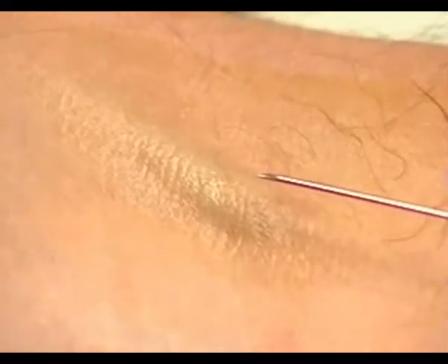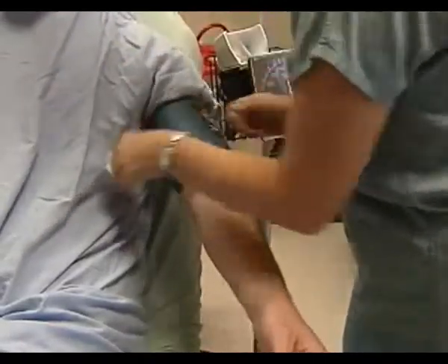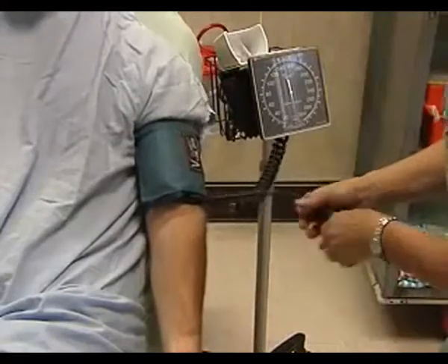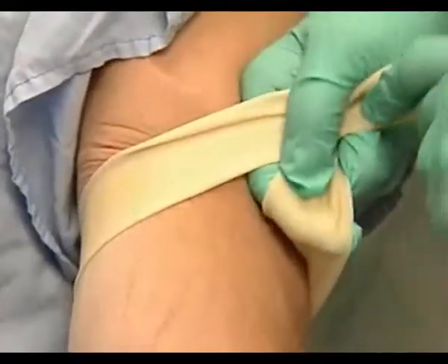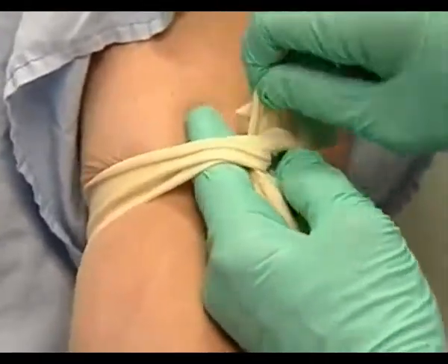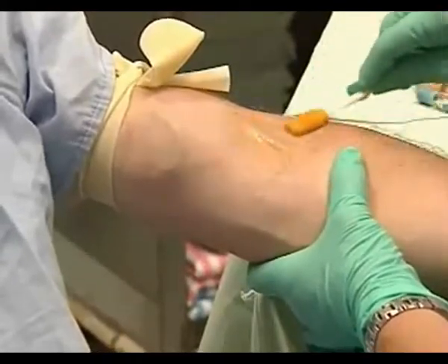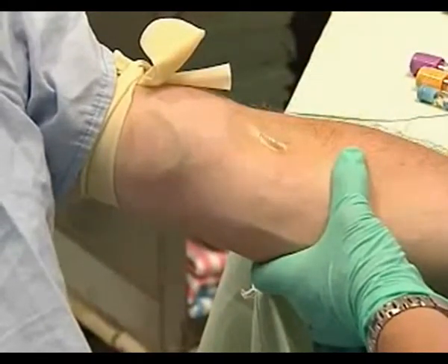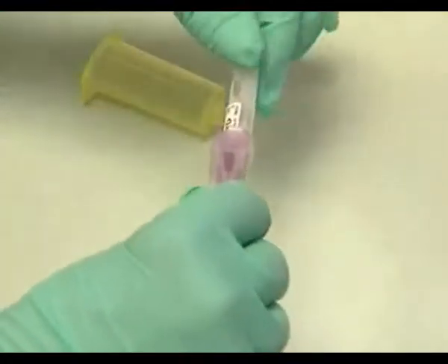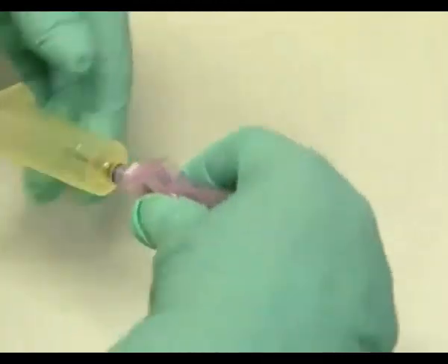It's one of the most common procedures you'll learn. We begin with the needle, vacutainer, and blood tubes. A blood pressure cuff can serve as a tourniquet to help you raise a good large vein in the antecubital fossa. Tying the tourniquet properly takes a little practice. The universal precautions for this procedure begin with gloves and careful cleansing of the skin with alcohol or betadine. Carefully remove the cap to unsheath the needle.